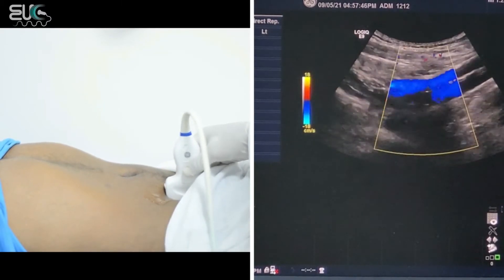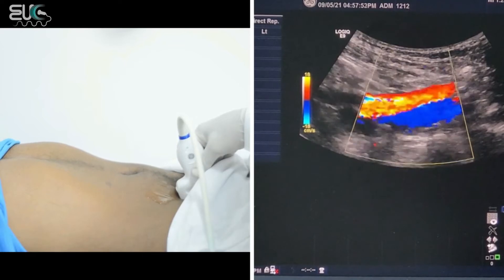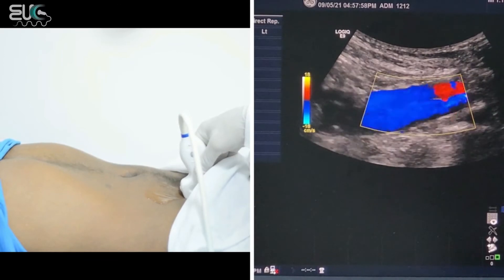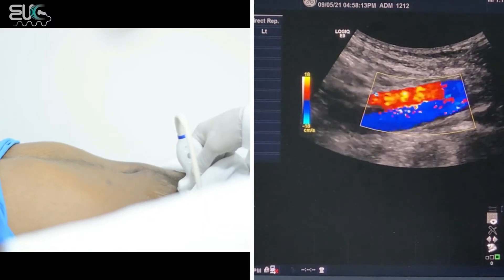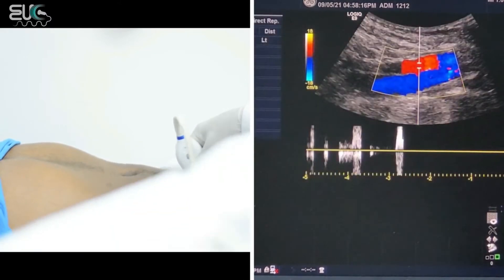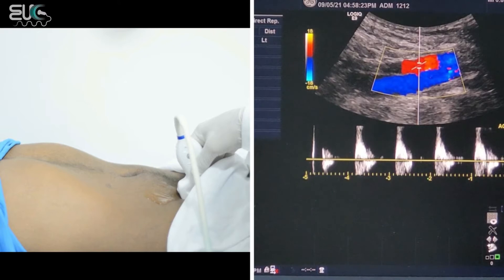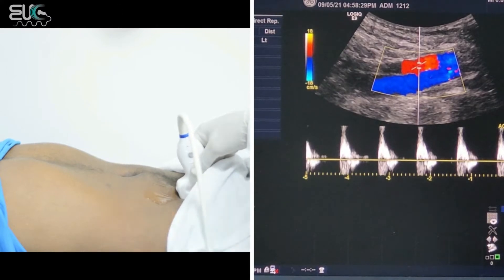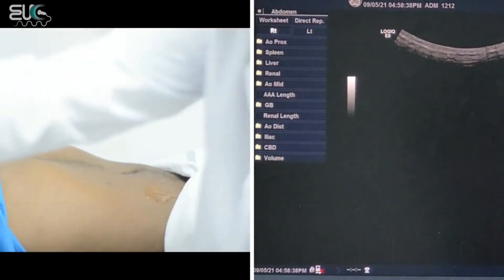Now I will add the color. I will start to focus on the external iliac vessels — we have the external iliac artery and external iliac vein. Now I will apply pulse wave to determine the velocity over the artery and to see the shape of the waveform. We have a high-resistive, triphasic waveform.